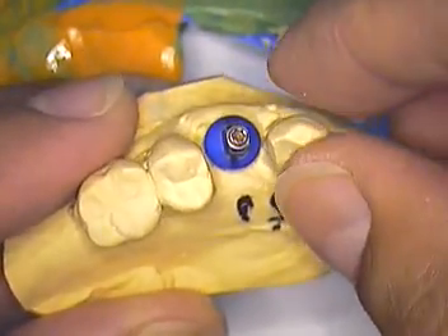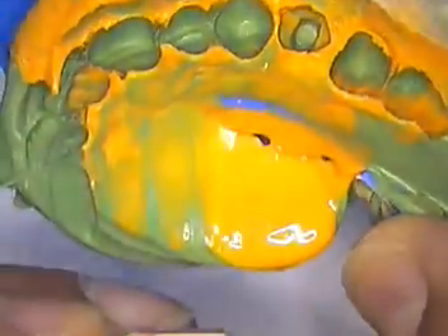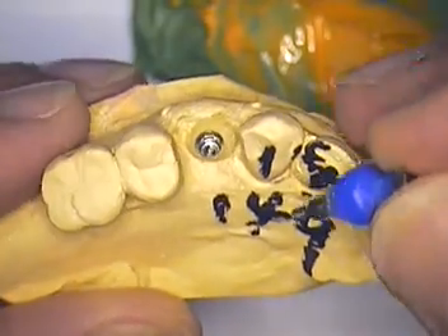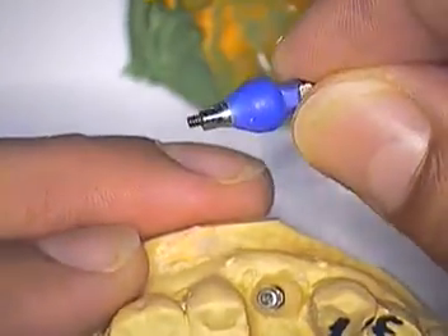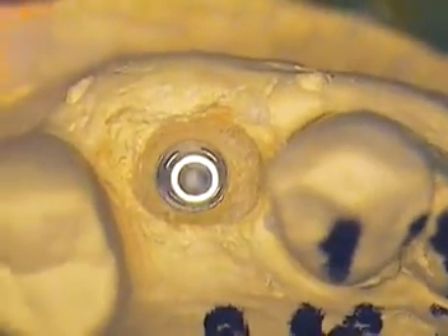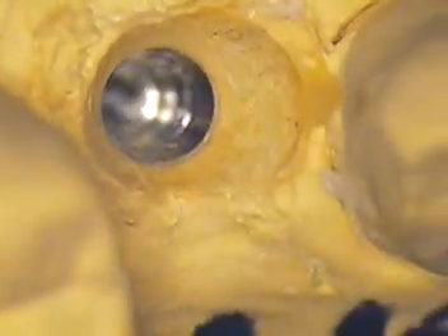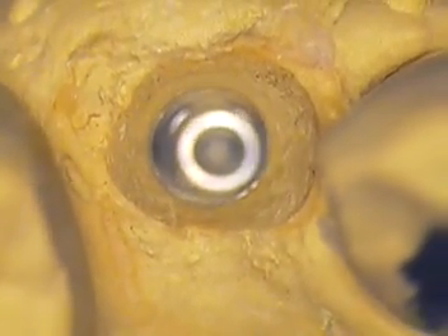We have a modified transfer coping in place. Here's the impression as we showed you before we did the pour-up. We have two pour-ups — this is actually the second pour-up, and it's a solid model. I'm going to remove now the modified coping, and you can actually see the detail — the replica of the undersurface or tissue side of this particular modified impression coping. When we zoom in, you can see debris all the way down inside, but also you can see the detail of the tissue and how it funnels down without any collapse whatsoever.